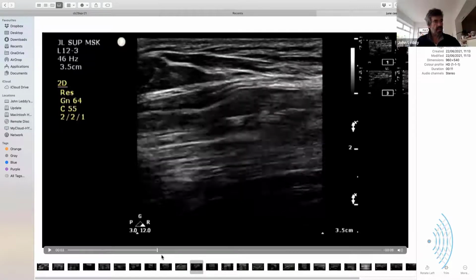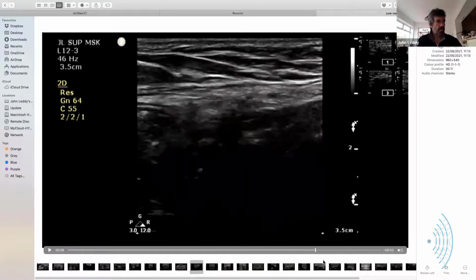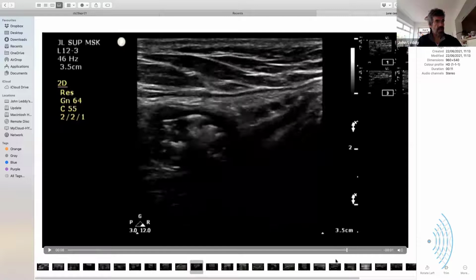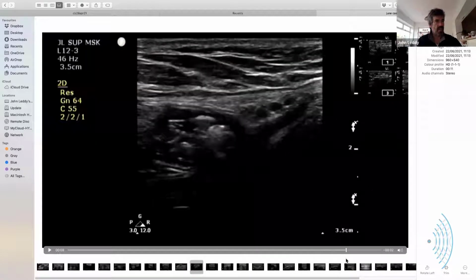level. And I usually try at the end of a clip just to show, but I think I was just there. Oh yes, there you go. There are some blood vessels there, possibly the inferior epigastrics, but it should really go over the top of them.